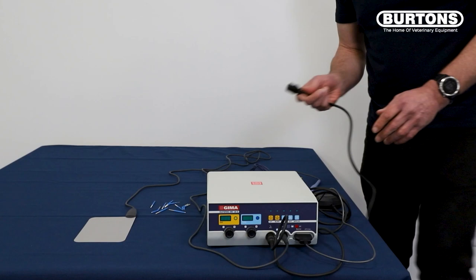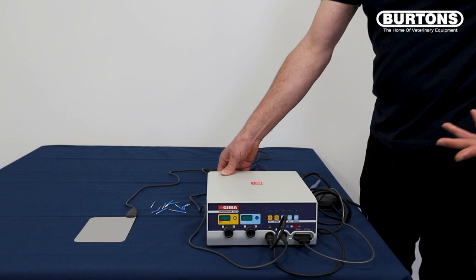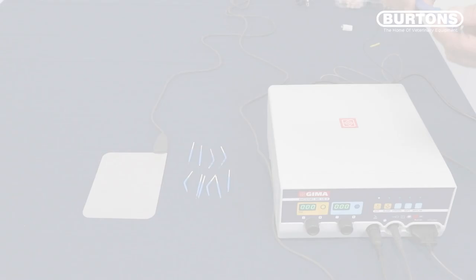We then have to connect the power supply to the back of the machine and switch it on at the back also. It will go through a few self-checks before you can use it. It passes all the tests, and then you're ready to go.